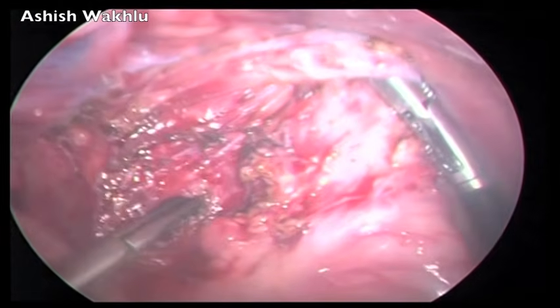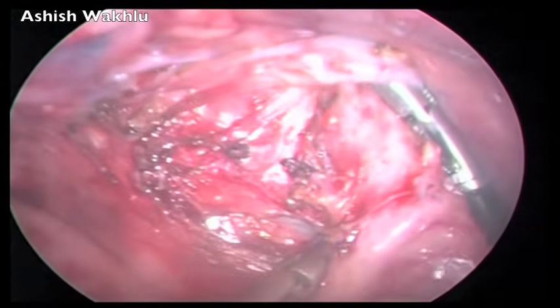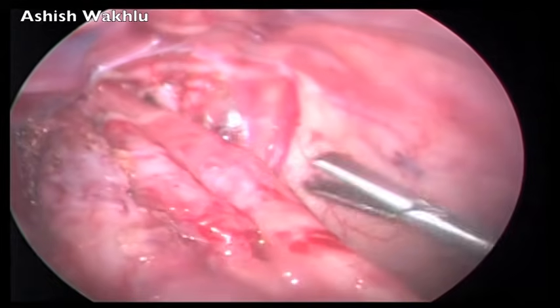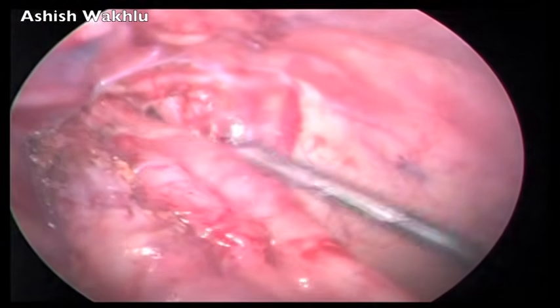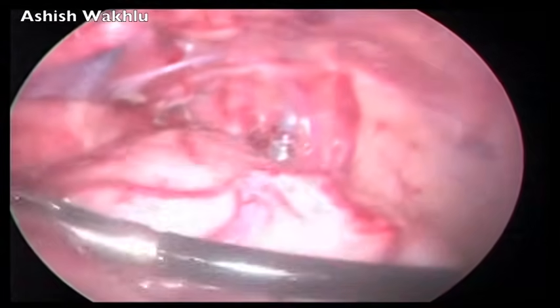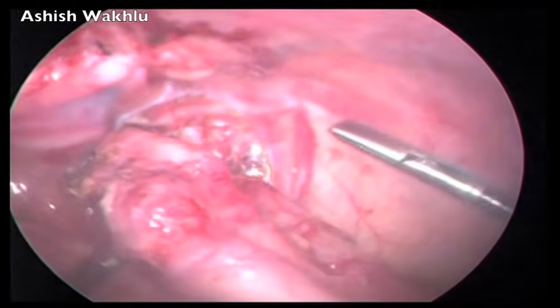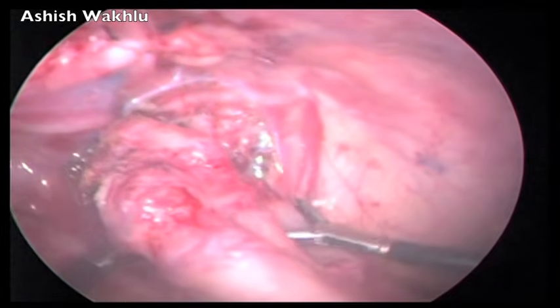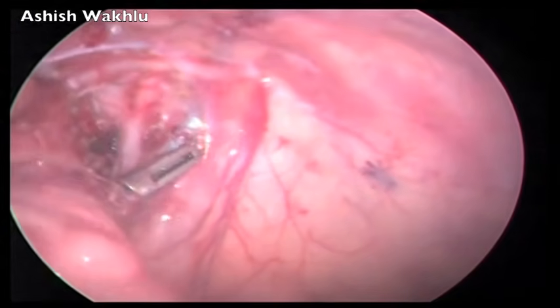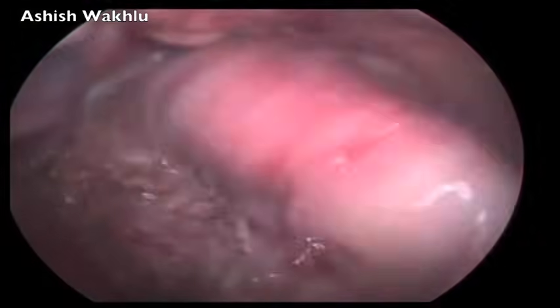And just to make sure that it is actually a gap and we haven't opened the rectum, a grasper is spread in the small opening. Due to the dilatation of the bowel, of course, it is not immediately visible on the other side. But by manipulating the rectum, we are able to confirm that we have gone through the mesentery at one point.